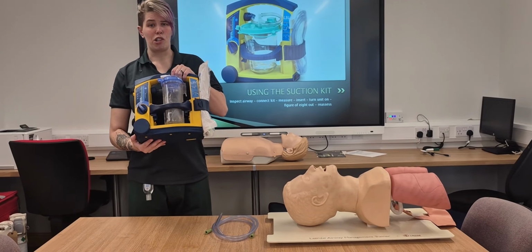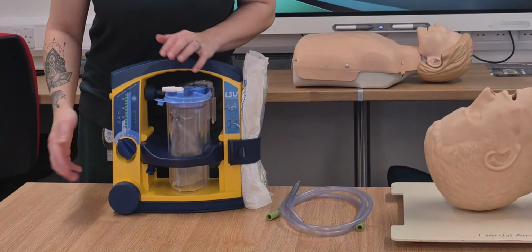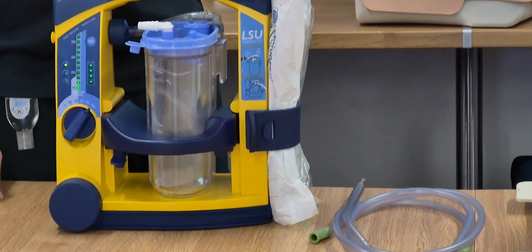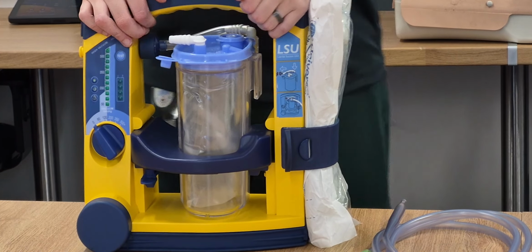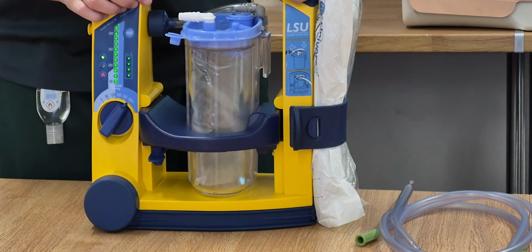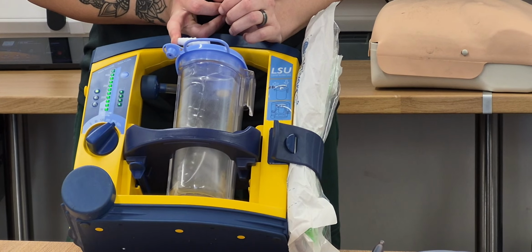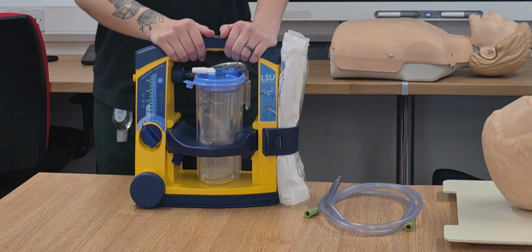Okay guys, so this is your suction kit here. We're going to have a look at the components on it first. What you've got here to start off with is your dial for turning it on and off, like so. For adults, you're going straight up to the top and back down again. You guys should be testing these on a regular basis, so that means removing them from the ambulance, turning them up to full spec and just testing it. You should get right up to the top. We are perfect, and just make sure that the battery's in good working order.